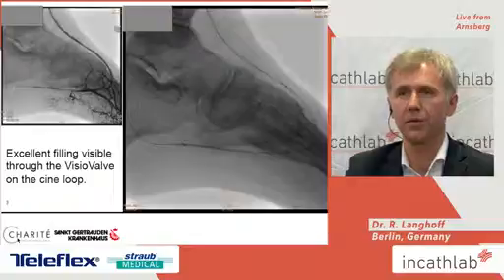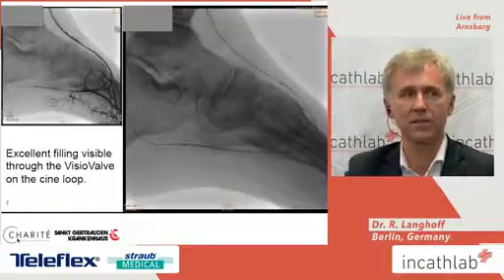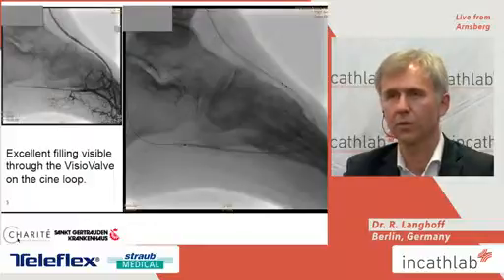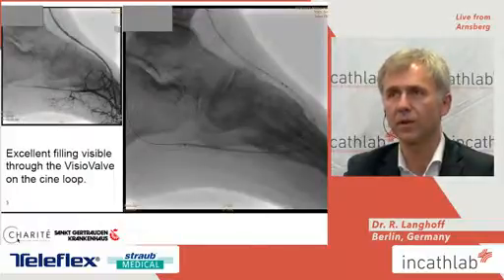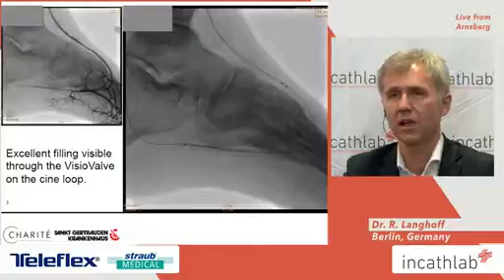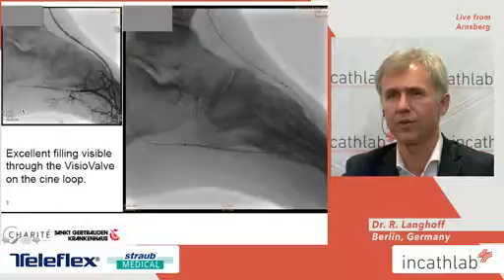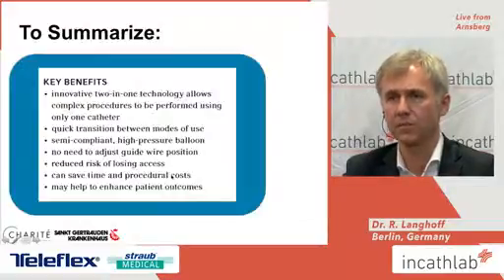So that's a picture from Marco Manzi, where he used the balloon in a pedal loop. You can see that the balloon is in place, the wire is still in place, and the small pictures show you the image that he really was able to tackle the pedal loop, and that he got a very sufficient and good angiogram by using this balloon.